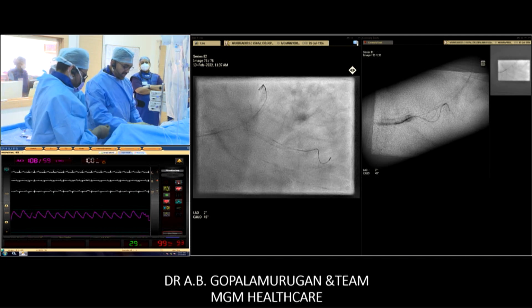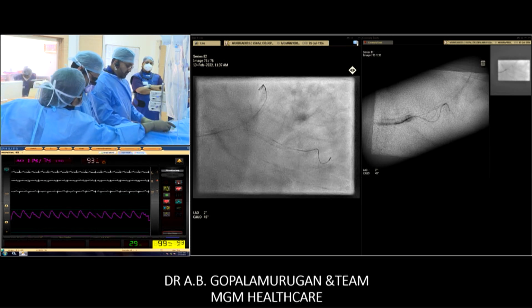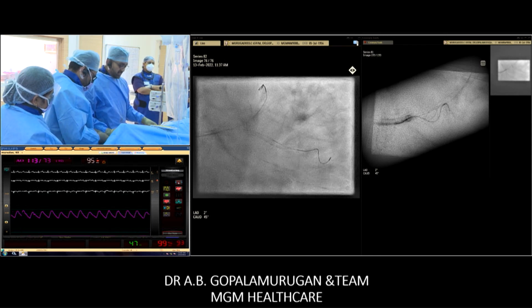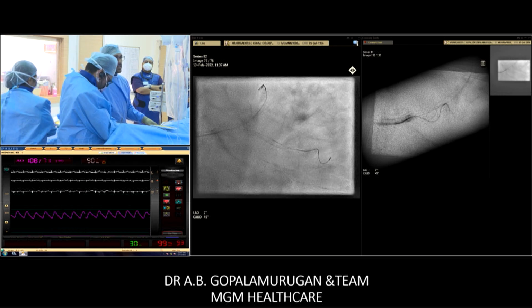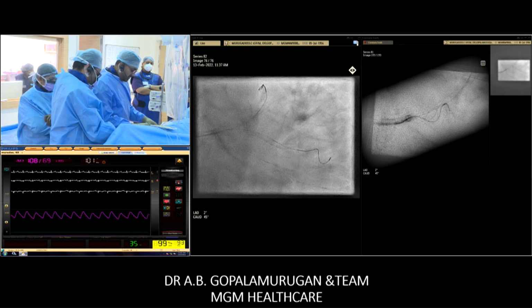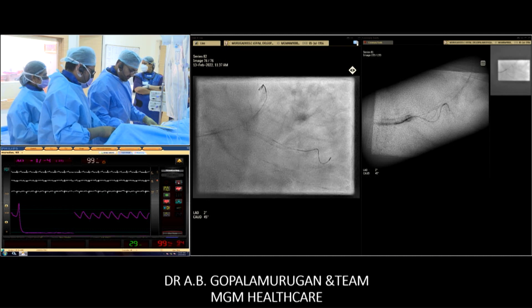One can argue that you don't need to dilate. Why don't you just stent across the LAD left main and then recross and then dilate? But this is just to make sure there's absolutely no way that we cannot get anything due to stent material in the jail. Gopal, actually, the last case was done from Calicut.